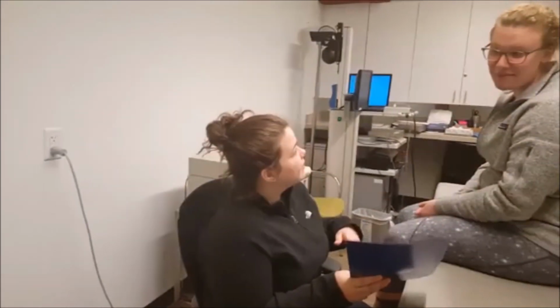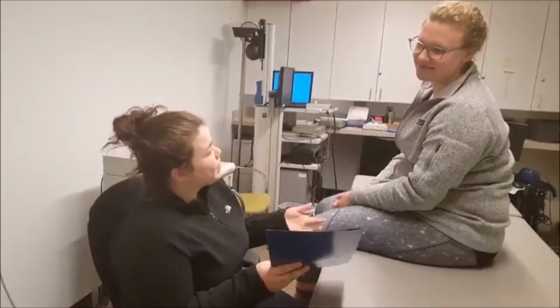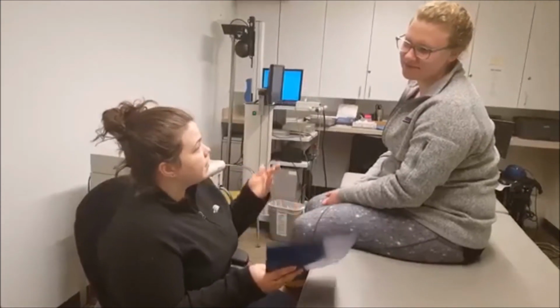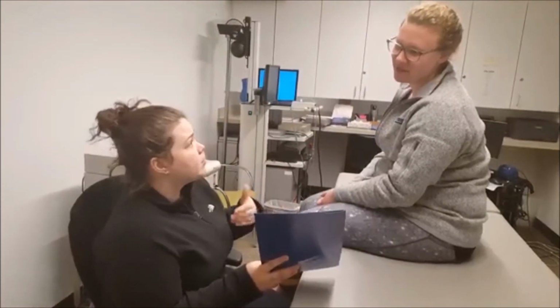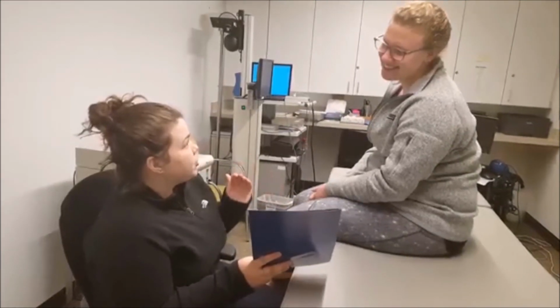Once the test is complete, the audiologist will come help you get out of the chair and counsel you on your results. Depending on your results, she could recommend more vestibular testing, possibly seeing another specialist, or participating in vestibular rehabilitation therapy with a physical therapist. So now you're ready for your appointment. Yay! I hope it eases your mind knowing what the rotational chair even is, why we use it for testing, and how that testing is performed.